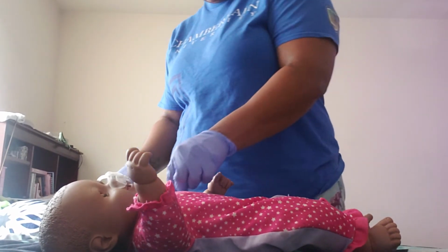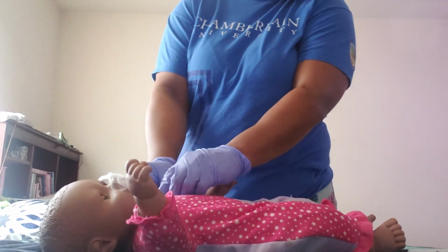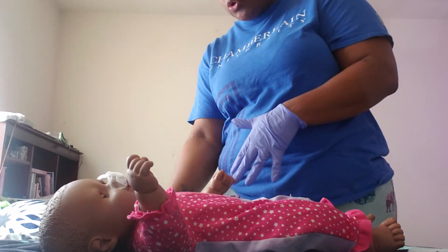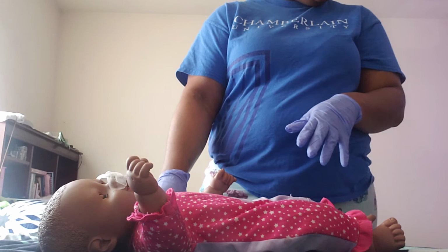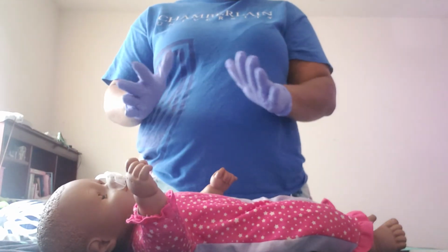And then I will take a third piece of tape and tape it to their gown so it won't snag. And then I will also clamp the tube to the connector. And I'll let the patient know that everything is completed, and that will be the insertion.